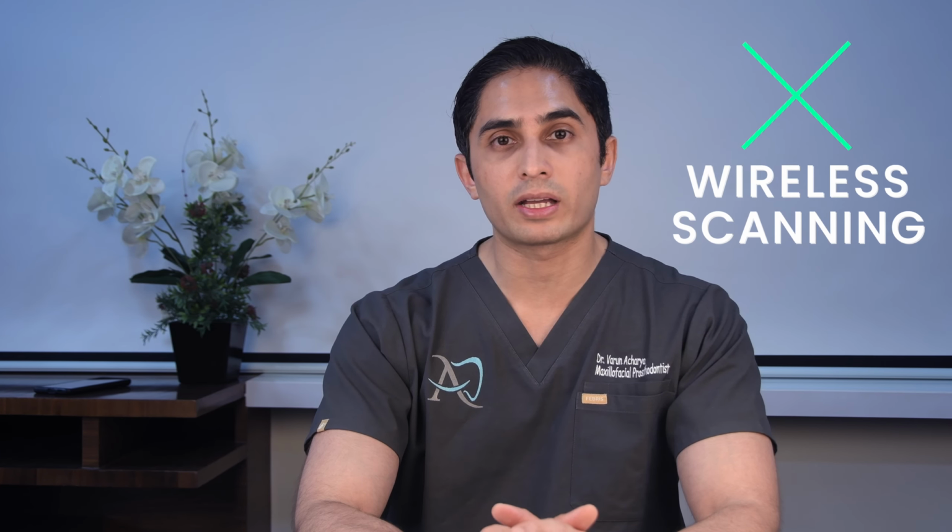Another big feature to talk about is wireless scanning. Most scanners on the market are wired. There are certain wireless scanners, such as the ones by Trios, 3Shape, and then there's also the DEXIS scanner, which was previously Carestream. Now Envista owns the Carestream intraoral scanning division, and it's called the DEXIS scanner. So there is a model of theirs which is wireless as well.